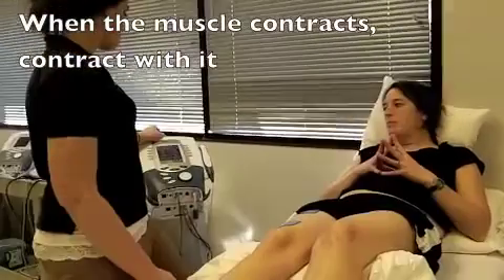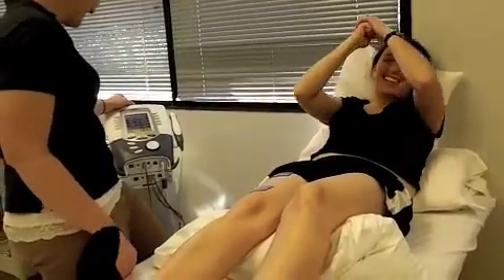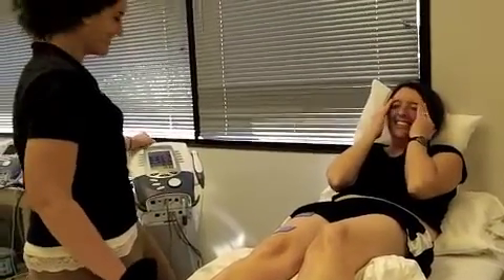Don't try to fight it. Alright, here we go. Can you contract with it? Can you contract with it?